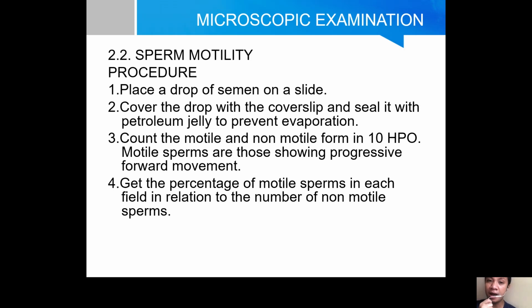Procedure for this one: you just need a concave slide. Place 1 drop of your liquefied seminal fluid on the concave slide, and then cover with a cover slip. Seal the edge with petroleum jelly, and then observe under 10 HPO.